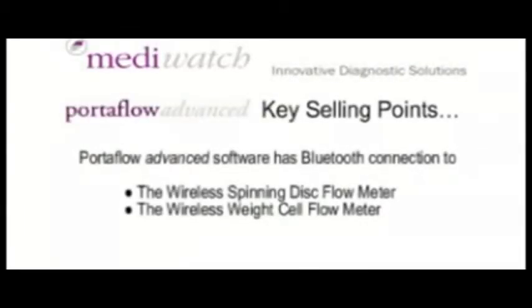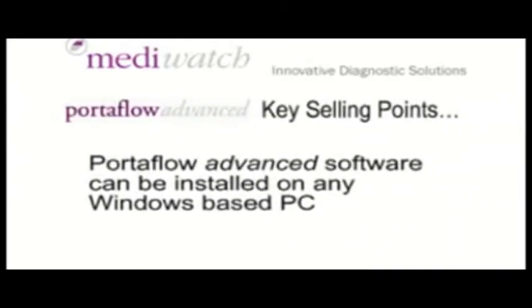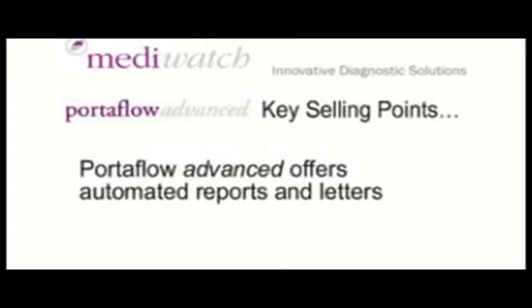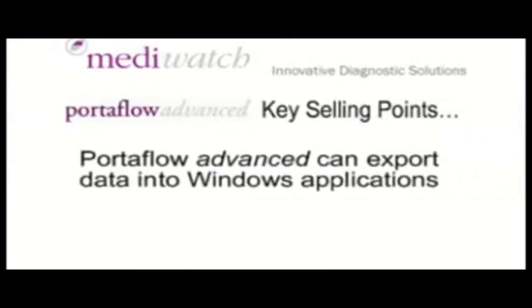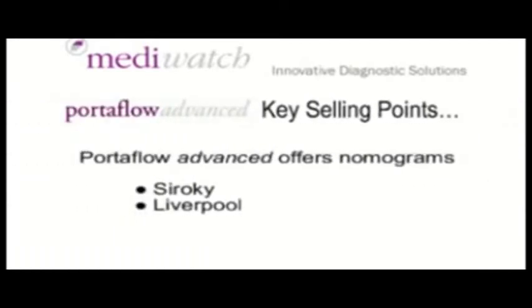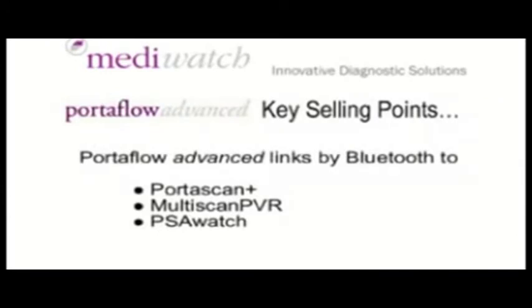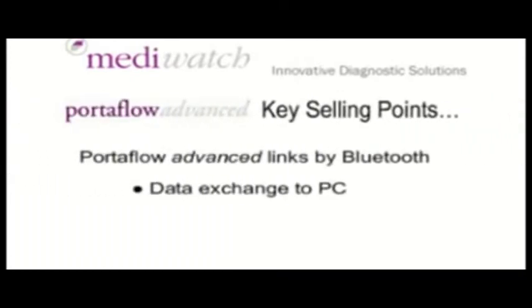Portaflow Advanced software has Bluetooth connection to the wireless spinning disc flow meter or a wireless weight cell flow meter. Portaflow Advanced can be installed on any Windows-based PC. Portaflow Advanced offers automated reports and letters, can export data into Windows applications, offers nomograms — both Siroky and Liverpool — and links by Bluetooth to PortaScan Plus, Multi-scan PVR, and PSA Watch for data exchange to the PC.